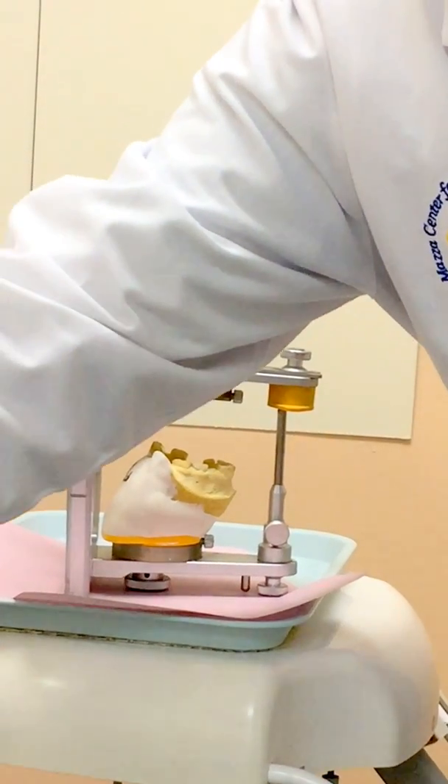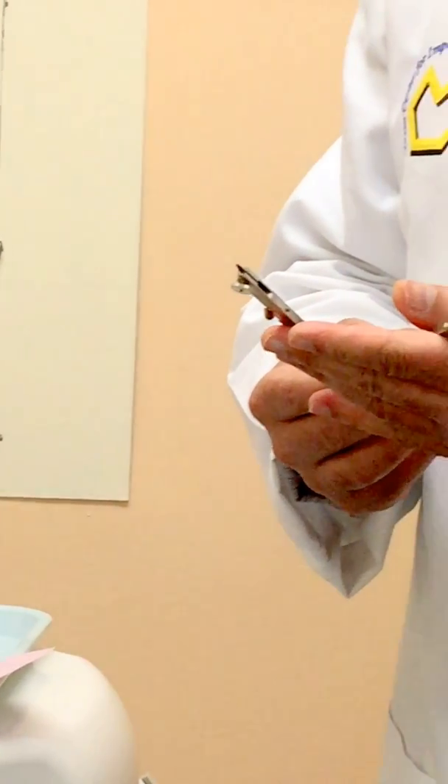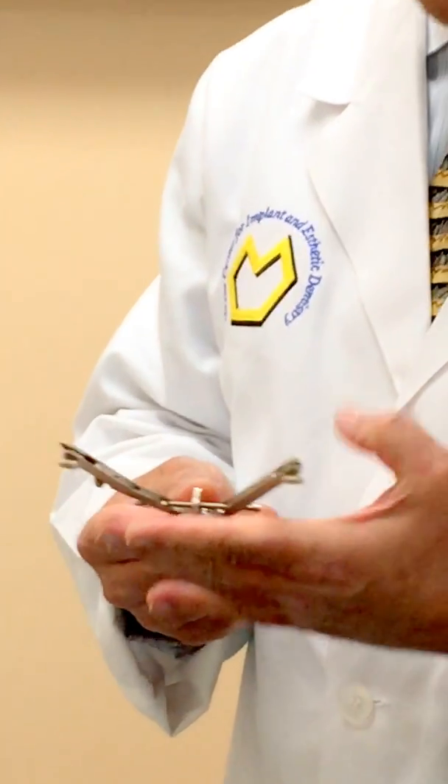I'm going to use a compass. I've opened the compass to four inches, which is going to be 100 millimeters or 10 centimeters.